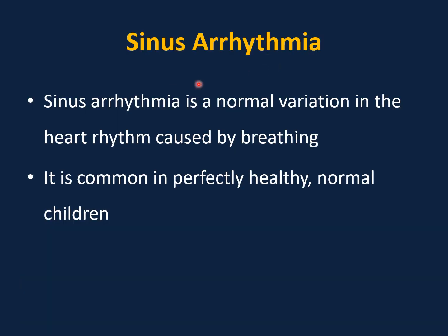Sinus arrhythmia is a normal variation in healthy children, a normal variation in heart rhythm caused by breathing. When we breathe in, this will create negative pressure in the chest and increase venous return. This will increase the heart rate slightly, and during expiration the opposite will occur. This is normal and requires just reassurance.